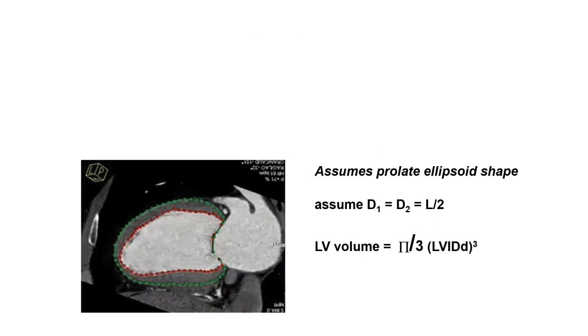Well, I'm going to take you on a little sentimental journey. I don't think you will be tested on this, but you may be curious as to how we actually derive a left ventricular mass from linear dimensions provided by echocardiography.